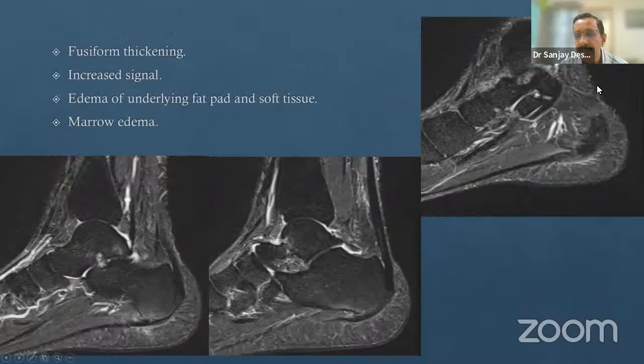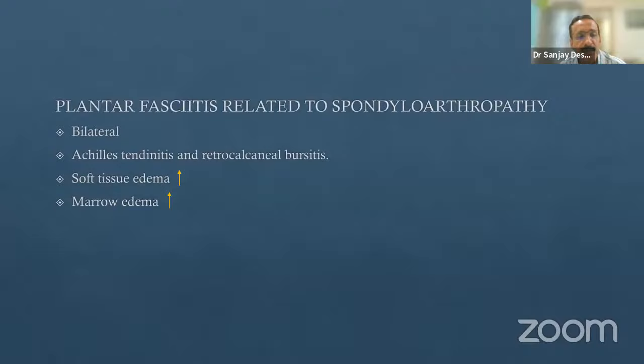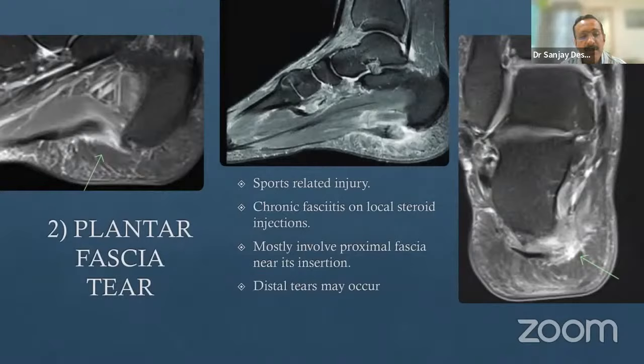This case shows significant thickening of the plantar fascia with surrounding soft tissue inflammation. When plantar fasciitis is related to spondyloarthropathy, it is usually bilateral, associated with Achilles problems like tendinitis, and retrocalcaneal bursitis, along with soft tissue and marrow edema.